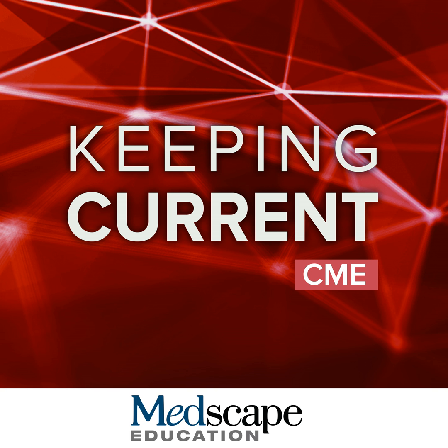The next case is a patient presenting with unsteadiness and brain fog with concern for stroke. So the current time point is listed as time point 2 on the bottom. And we have for comparison time point 1, which was a year earlier. We see in retrospect on that prior exam, there's patchy edema in the left occipital lobe, which has subsequently resolved. On the current time point, though, there is new right occipital edema, T2 hyperintense signal in the subcortical white matter, as well as a small sulcal effusion.